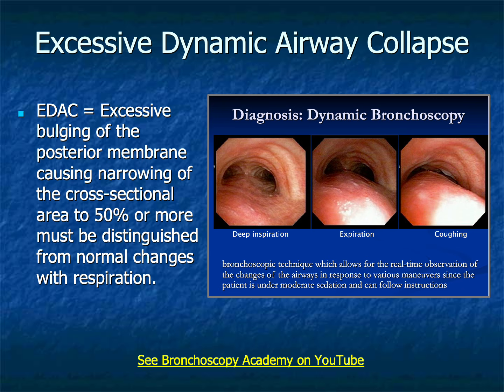We thus learn that we can watch airway function by performing bronchoscopy as an observation over time, not merely as an isolated inspection.